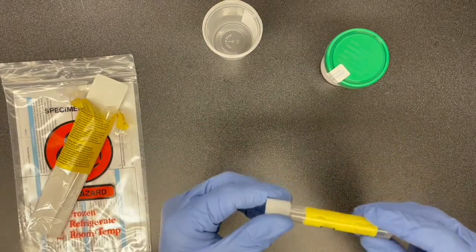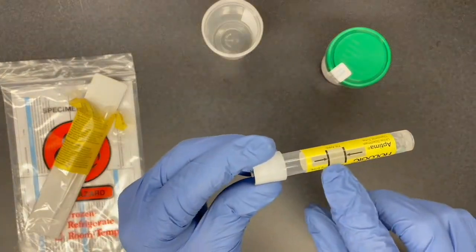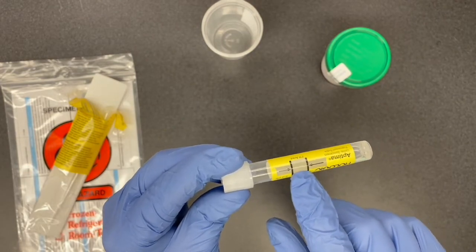So on this tube, you're going to notice there's two black lines here. Later, this is going to be the goal for the amount to be filled.